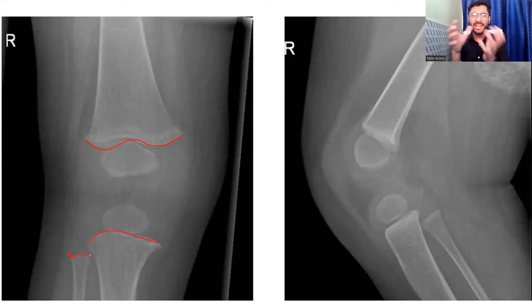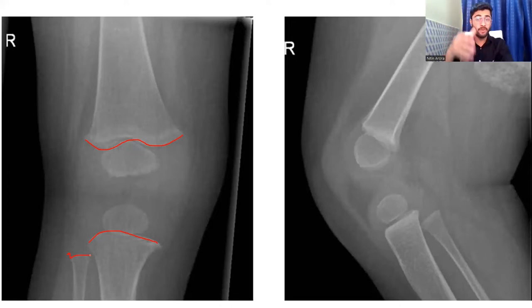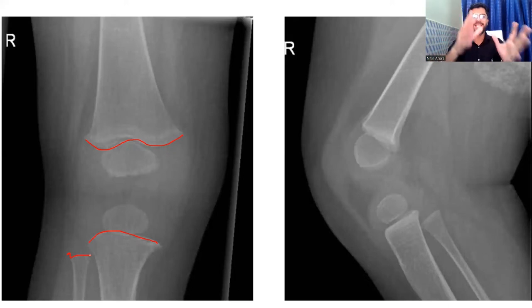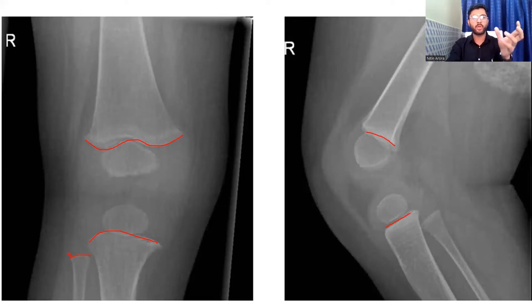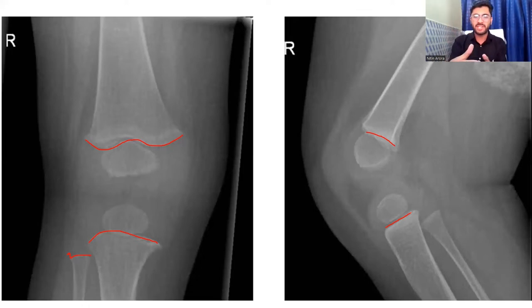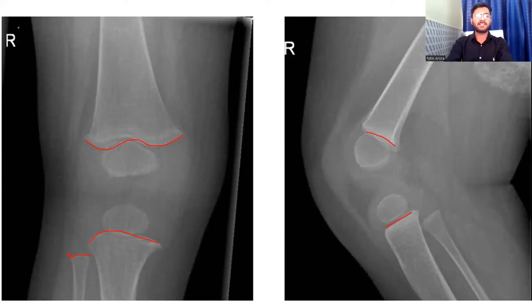If you see some irregularity on this AP or lateral view, apart from these normal growth plates, then that might be a problem — there might be osteosarcoma, some type of bone tumor, fracture, or a greenstick fracture. The R written here indicates that this is an x-ray of the right knee.